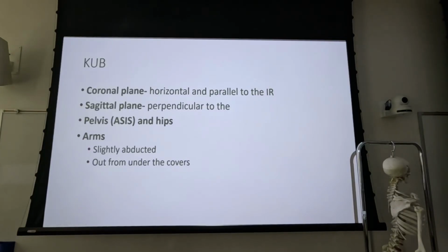All right, because what happens in a lot of cases is that, you know, it's cold, right? So you get your patient perfectly positioned and they've got their arms under the covers and they're laying there for a little bit and their elbows are digging into the table. What are they gonna do? Bingo, they're gonna put their hands across their stomach. Anybody seen this happen? If you haven't, you will. So keep their arms out from underneath the covers.